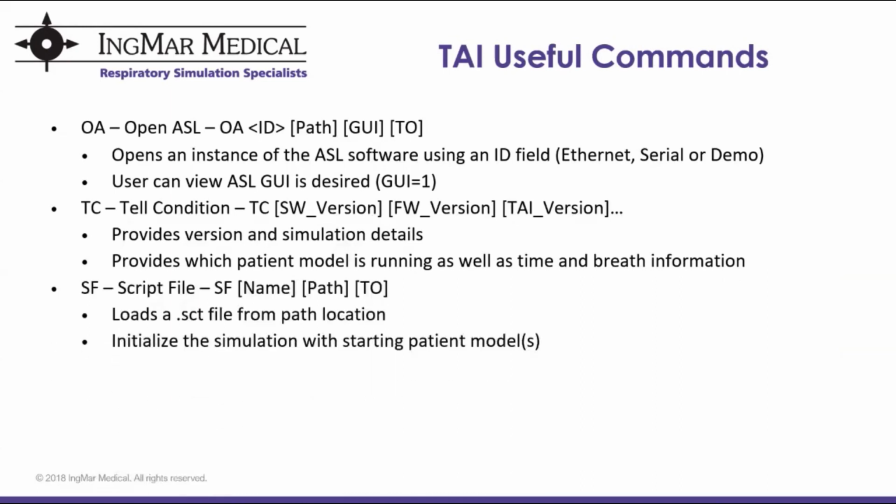The SF, or script file command, is used to load a .sct file. For those already familiar with the ASL software, the .sct or script files contain one or several VR3 or patient model files. The SF command typically loads the initial patient model for the ensuing simulation.